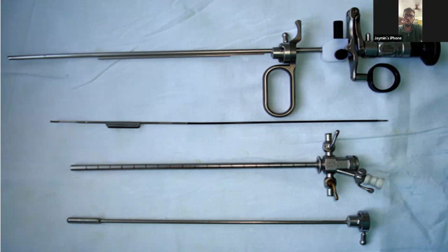So height generally is 60 centimeters from the table. 60 to 90 centimeters, sir. So it is usually 60 to 100; 60 or 70, either of them is acceptable. Next.